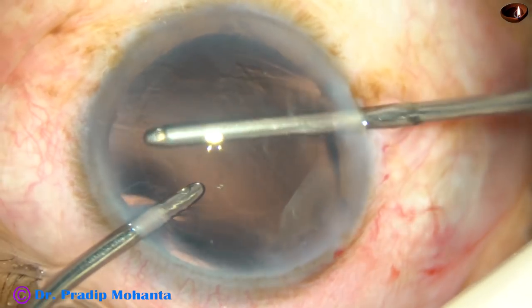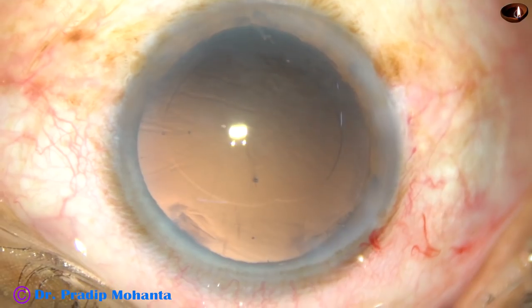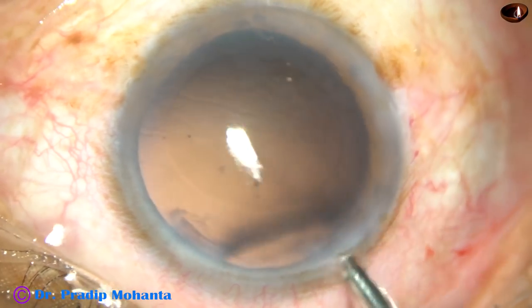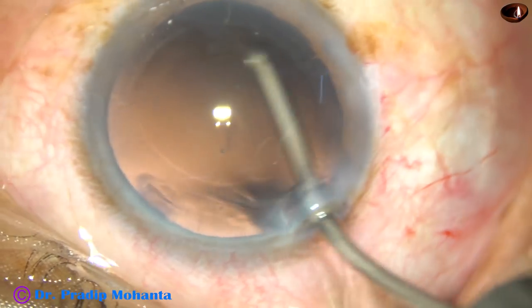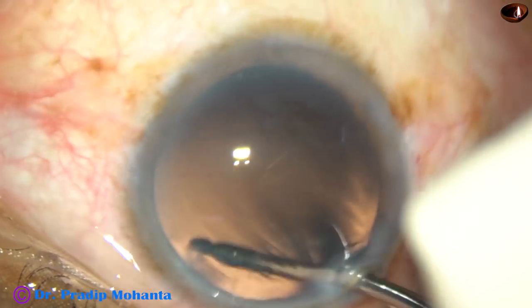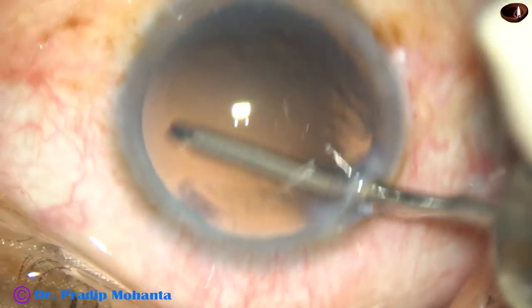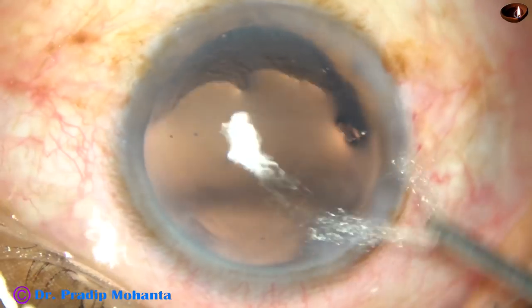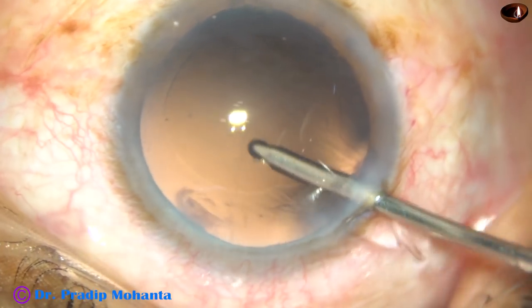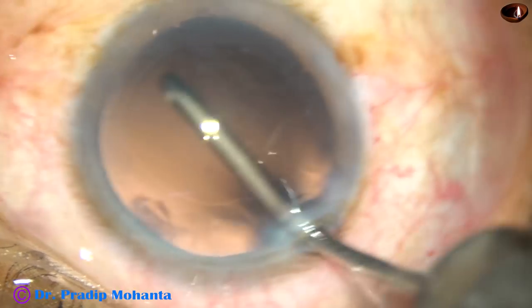So the cortex is removed. And now this is hydropolish — use the fluid jet, direct the fluid jet towards the posterior capsule, and move the probe sideways.